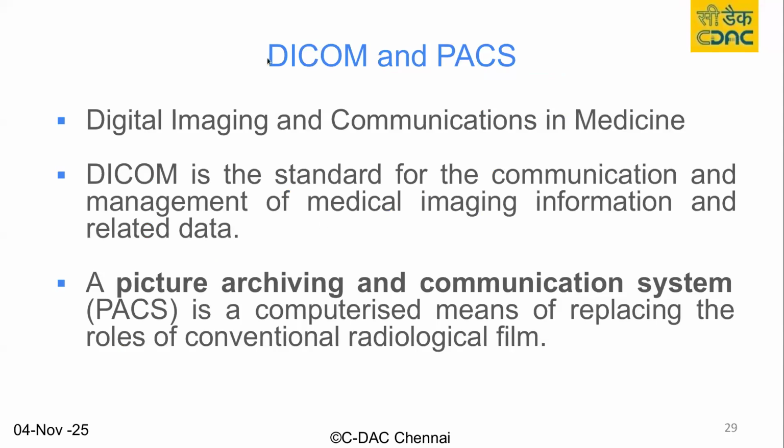So, as I said, DICOM is a digital standard, Digital Imaging and Communications in Medicine, which is a standard for representing medical imaging in the healthcare sector. So most of the current X-ray machines use a picture archiving and communication system. It is a computer means of replacing the roles of conventional radiological films.